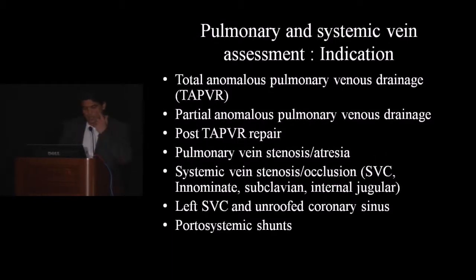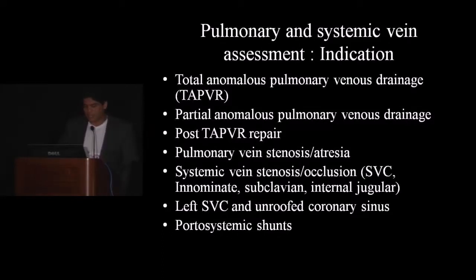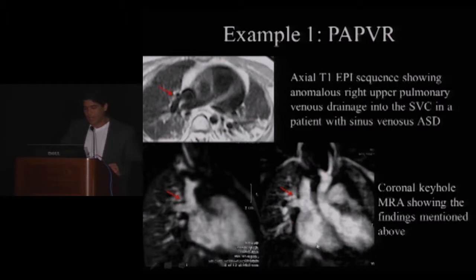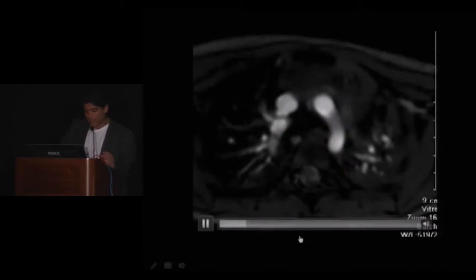I'll go case-based and share examples where MR angio and MRI have been very helpful in looking at anatomy and answering clinical questions. Clearly, total anomalous pulmonary venous connection, partial, and post-repair cases are well-suited to this technique. My first example is a patient with anomalous partial venous connection, showing the right upper pulmonary vein hooking anomalously and draining into the SVC. This is demonstrated on the black blood technique and coronal reconstructions from a 3D MRA.